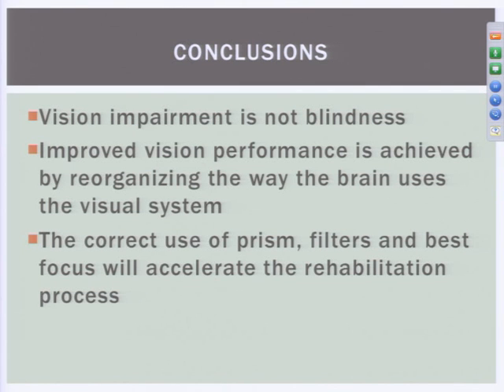Yes, her question was in terms of glare. We do want to apply anti-glare treatments, and a lot of times your regular doctor can prescribe anti-glare coatings on lenses. That's pretty common. But again, if your doctor feels that your problems are beyond the scope of what can be done in a regular examination situation, they would usually refer you to us to work with that. The filters can be applied anytime, but we usually grind them into a new prescription, and we want to make sure that we make those glasses when you're stable and not when you're subject to change.